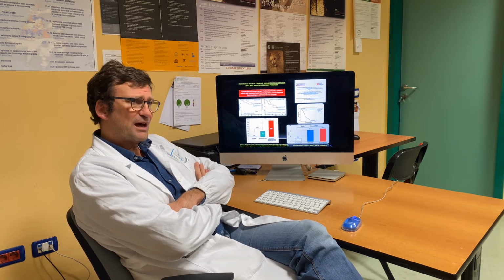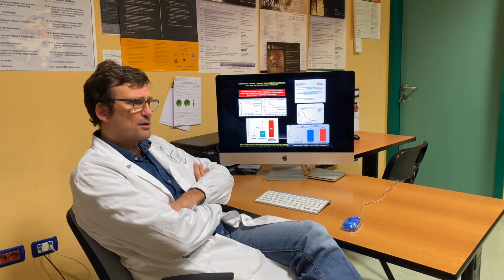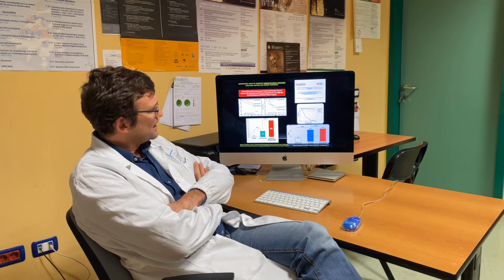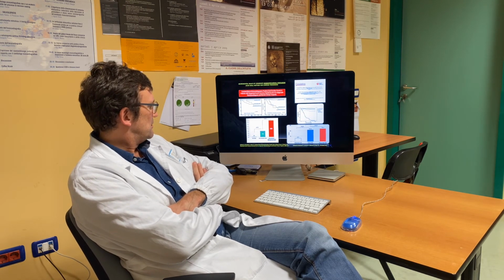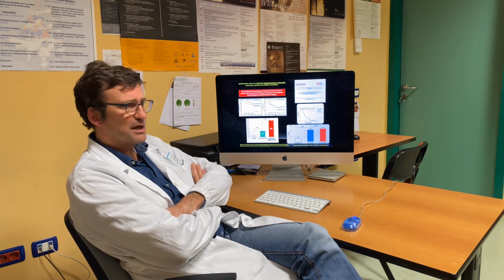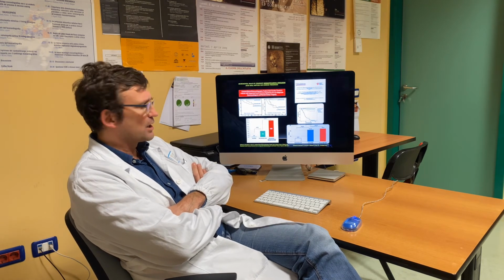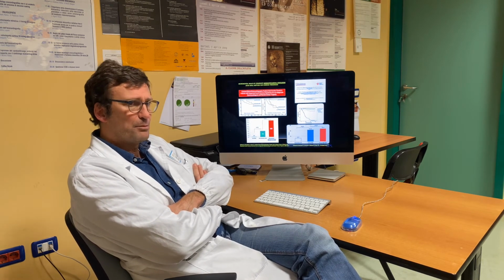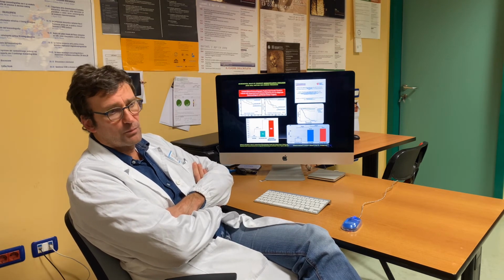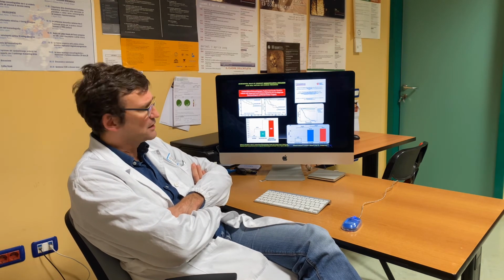But I have to say that well earlier than me, Tom Porter in particular started collecting this data, and there are a couple of papers in the European Heart Journal and Circulation that he and his group published regarding the incredible power, capability of perfusion to stratify prognosis for heart events, I would say myocardial infarction and mortality basically.